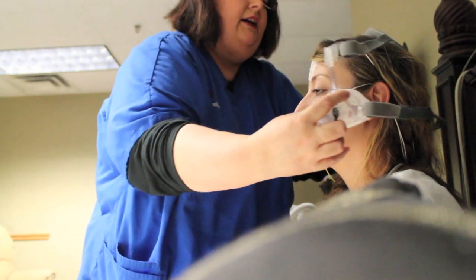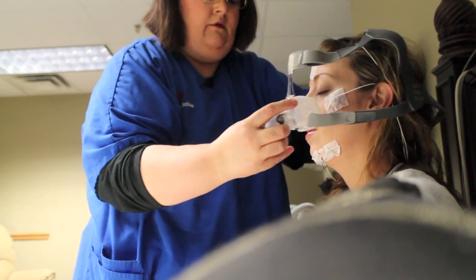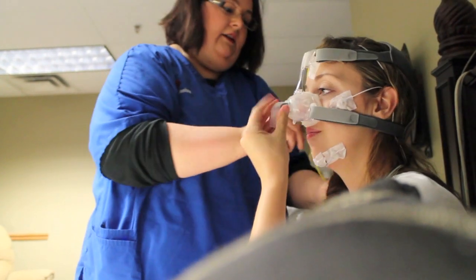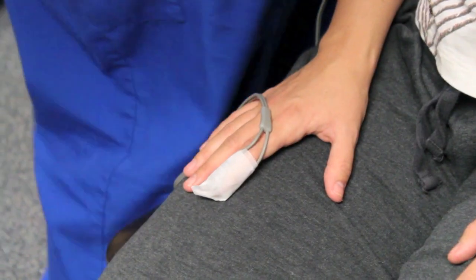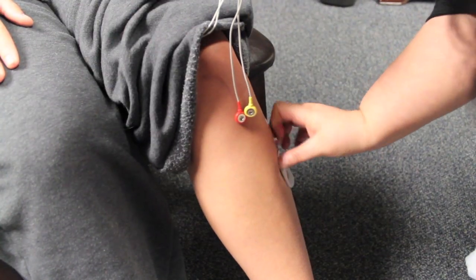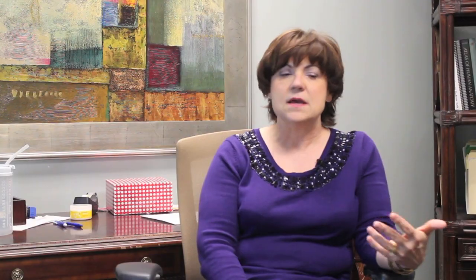We can check breathing in your nose and breathing in your mouth, and then it comes around your head. There's a one-lead EKG just to see what your heart rhythm is doing. There's a pulse ox that we put on your finger so we can monitor your oxygen saturations. Then we have a lead on each leg to see if we're having any leg movement.